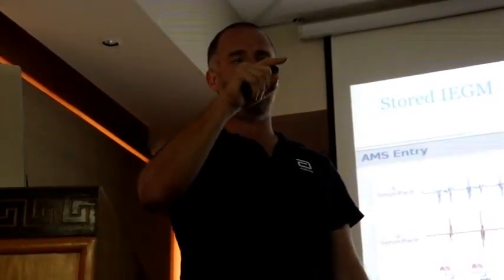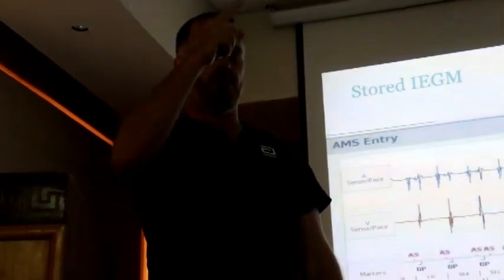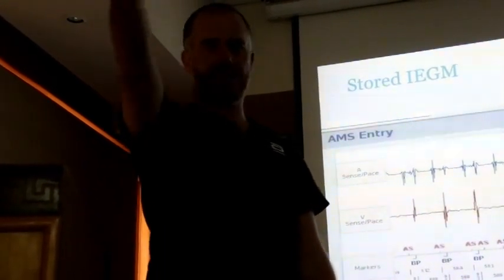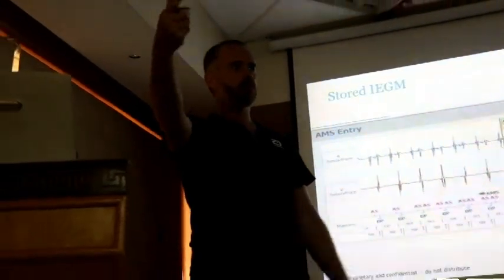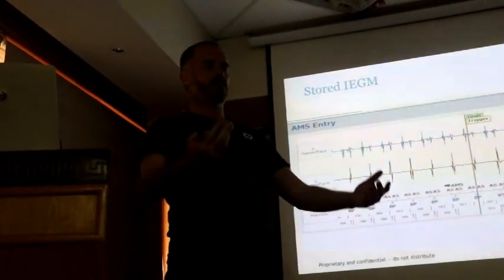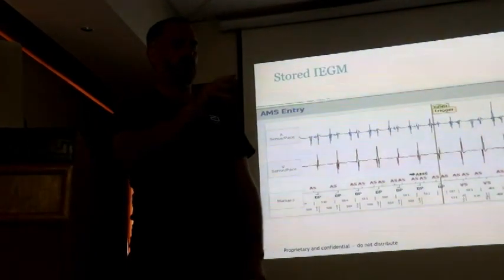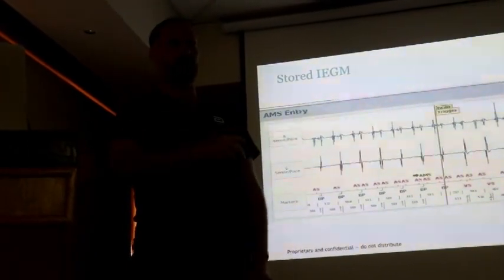So really rare. There's only one time, and it happened 6 weeks ago, where I've had to change the decay delay threshold start on an atrial lead, and it was for far field P wave oversensing. So the atrial lead sensed the right atrial signal, and then it sensed the left atrial signal. Quite cool. Common? No, I haven't seen it often. I saw it 6 weeks ago.